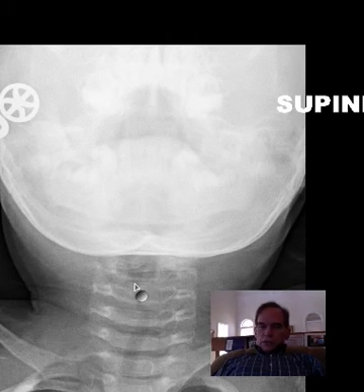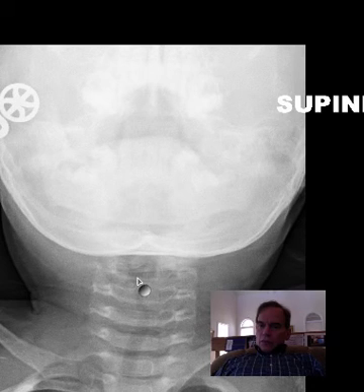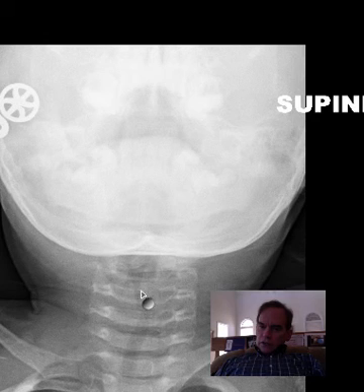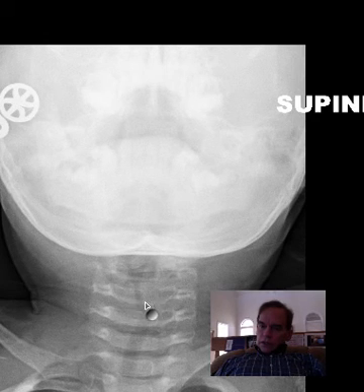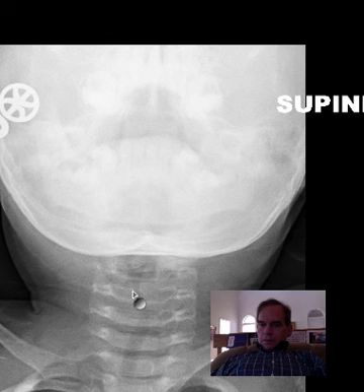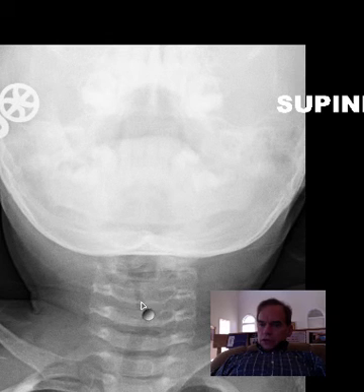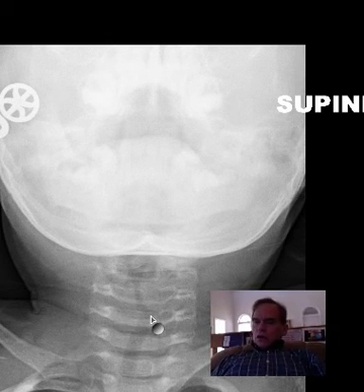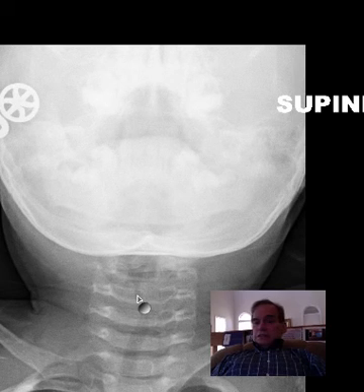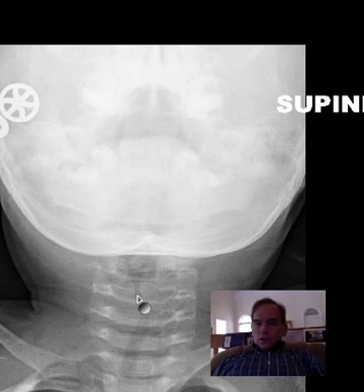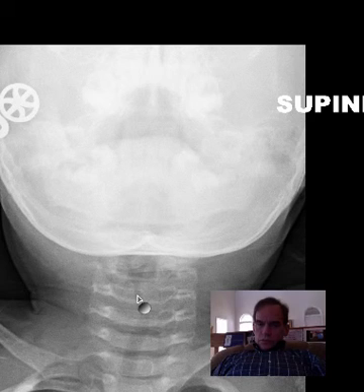What we see is irregular narrowing below the level of the glottis — the vocal cords. Inferior to that level there is an irregular narrowing for a short segment. In this case it's more of a long segment because it must be a rather severe example of croup.